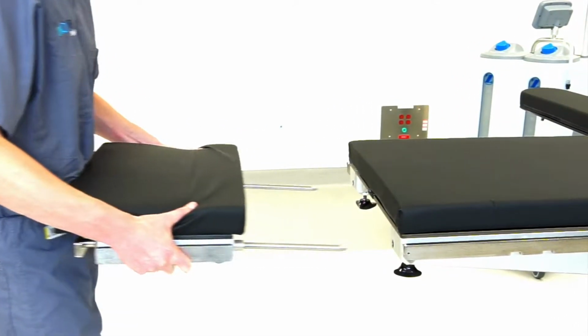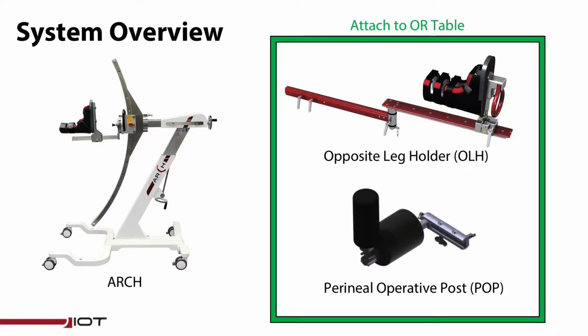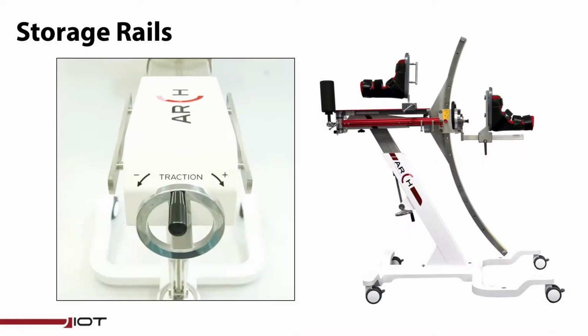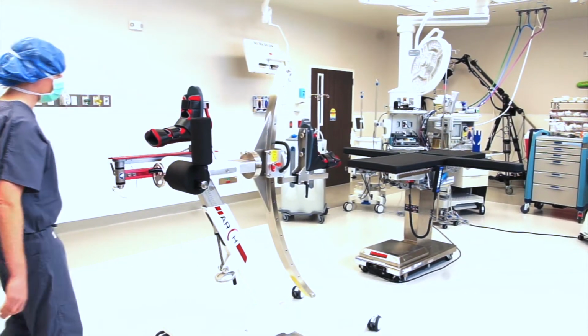Remove OR table head section. Lock the OR table in place. There are three main components in the system: the arch, opposite leg holder or OLH, and the perineal operative post or POP. The arch is freestanding, and the OLH and POP attach to the OR table side rails. The arch has two storage rails to hold the OLH and POP when not in use. Roll in the arch and position near the end of the OR table.